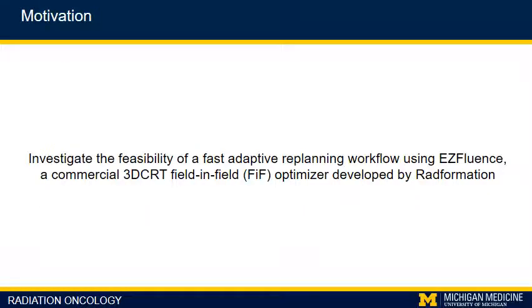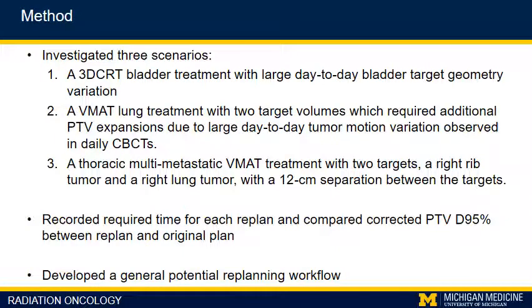The goal of this work was to investigate the feasibility of a fast, adaptive replanning workflow using EZFluence, a commercial 3D conformal radiotherapy field-in-field optimizer developed by Radformation. To investigate this, we tested three scenarios using the data from previously treated patients. The first was a 3D CRT bladder treatment, which showed large day-to-day variation in bladder filling.